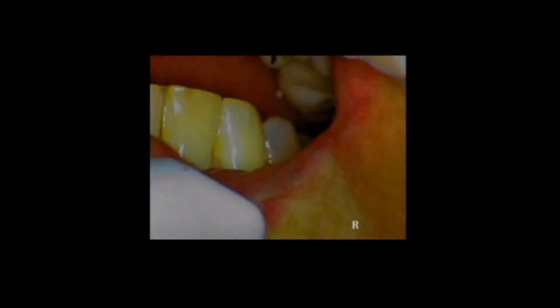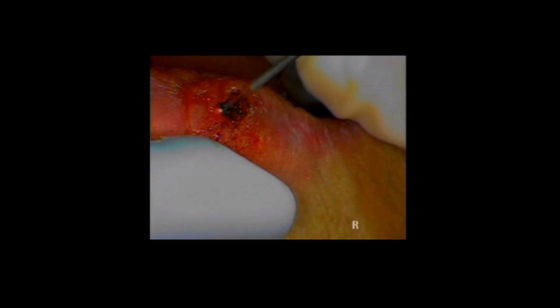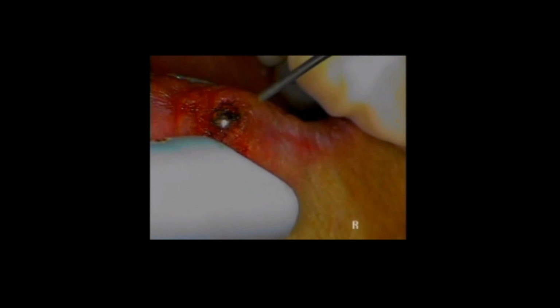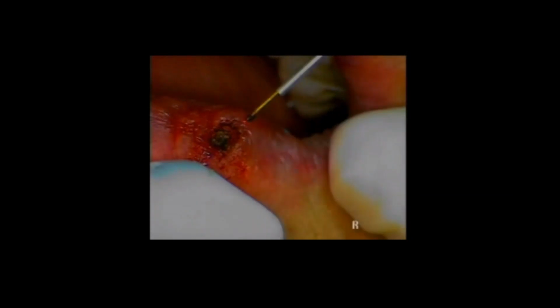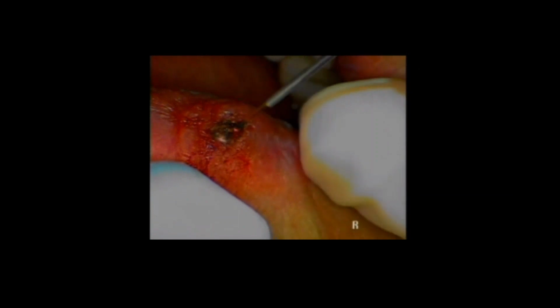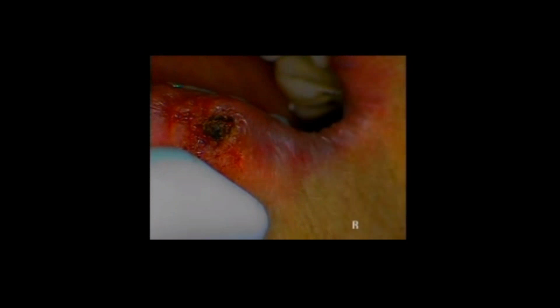So at this point, the little area of the lip is oozing a little bit, and we're just drying it up and stopping the little bleeders so the patient has a completely coagulated lip area before they leave. At this point, just clean it up, use a little peroxide, and put some vitamin E on it. They just apply vitamin E for a couple days.